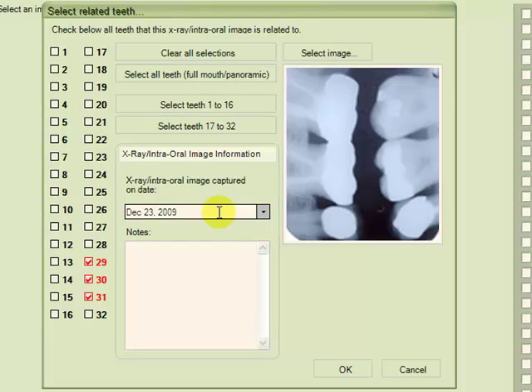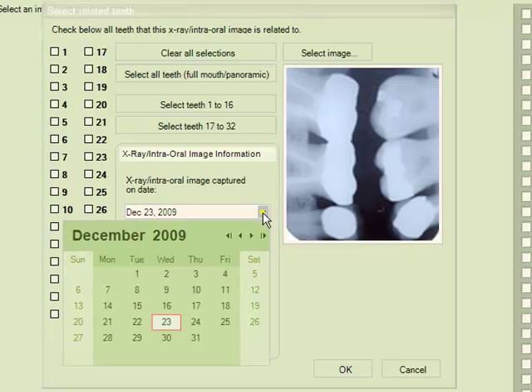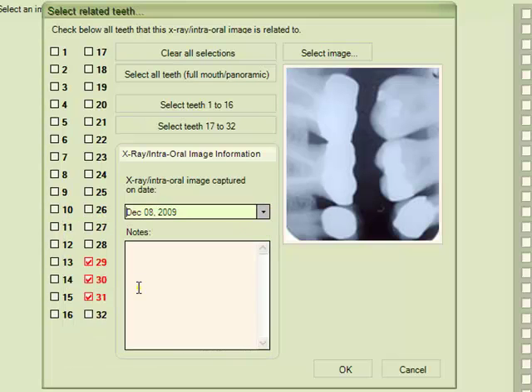If the date is wrong and we know that the image was captured on a different date, we can use the drop-down box here and edit the date. We can also add any notes that we'd like.